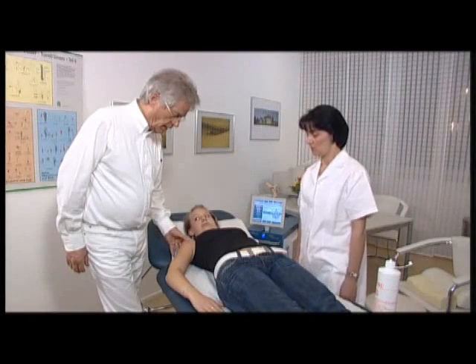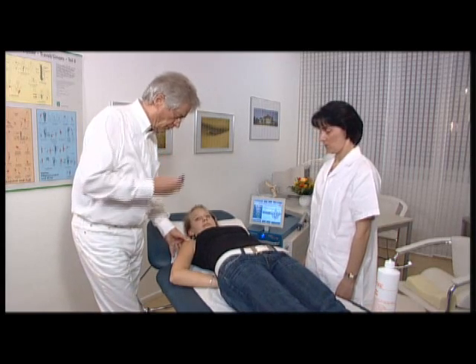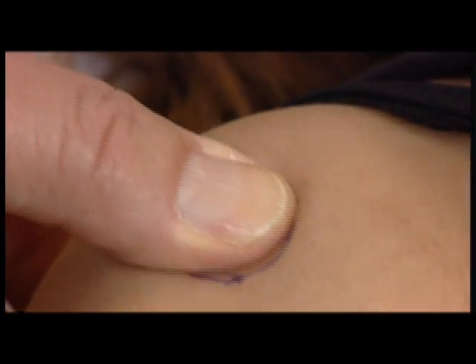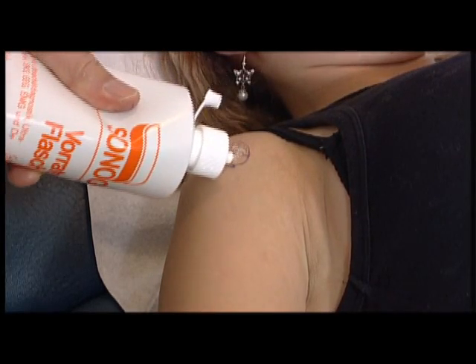Bitte mal auf den Handrücken setzen. Komm, richtig schön anbeugen. So, wunderbar. Und damit haben wir diese Stelle. The doctor marks the painful region and places the applicator in position. The patient is treated with 1000 pulses.